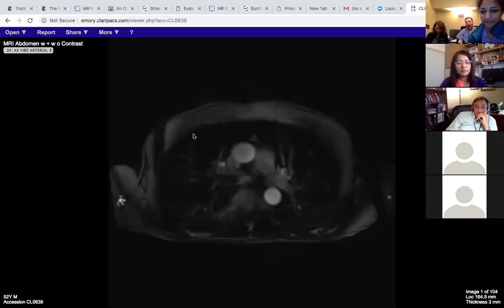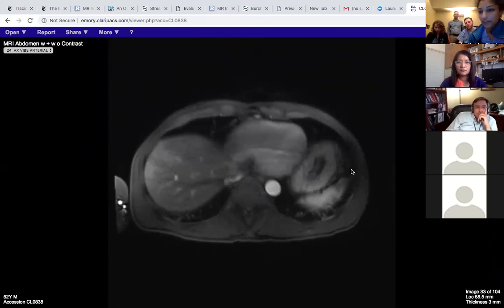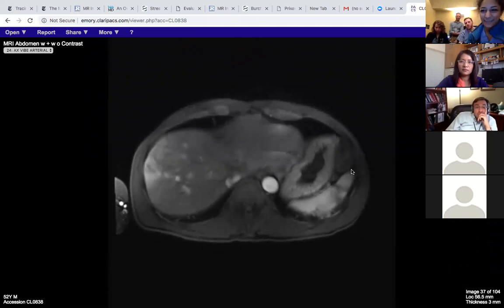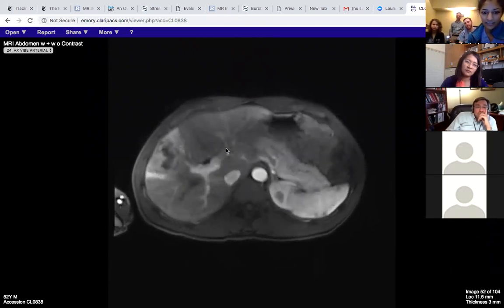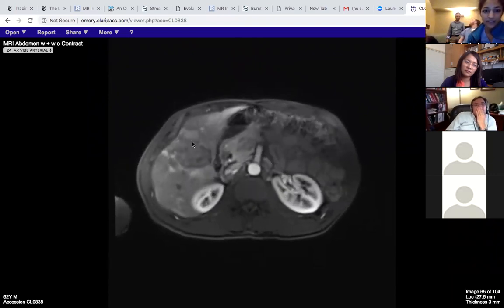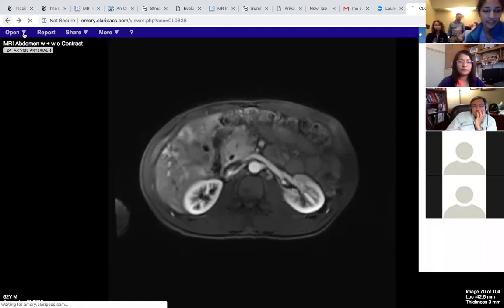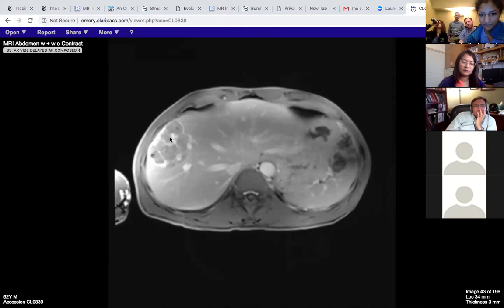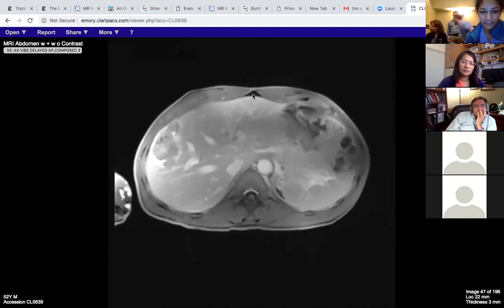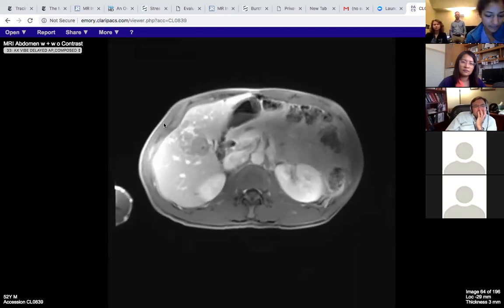This is the third case: a young homeless gentleman whose liver was normal six months prior. This is Linton's case, presented on his behalf. Six months ago the liver was normal, and now we have this big mass in the liver — and this other big mass. You can see my arrow. That was the arterial phase, showing arterial enhancement. In the venous phase it's fairly homogeneous but has what looks like vessels going through it, or some internal structure, with a similar appearance inferiorly.